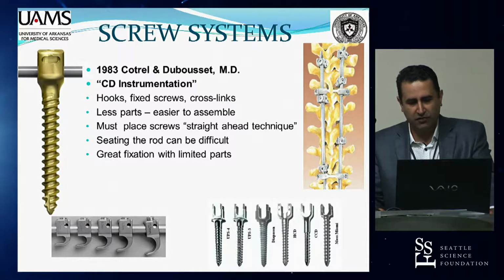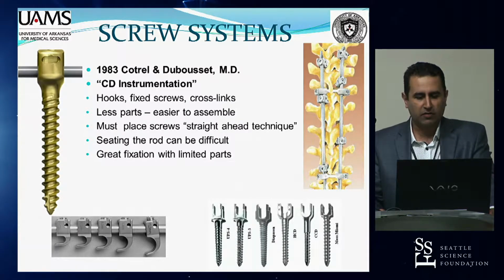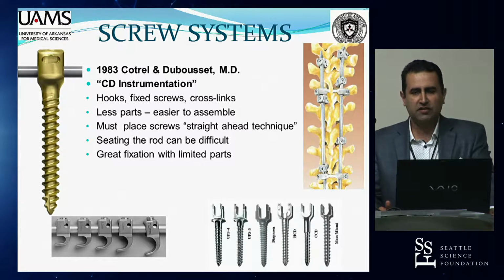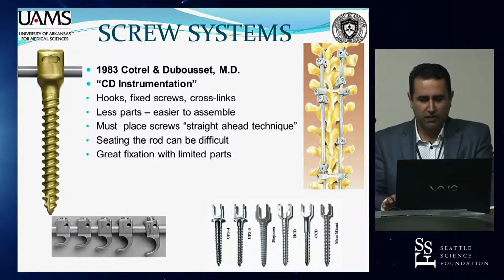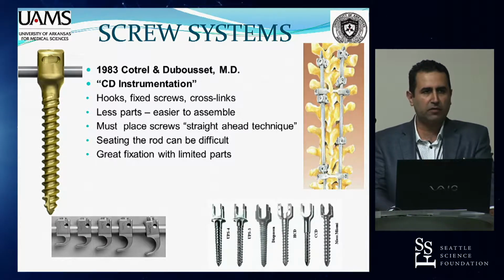It was cumbersome to some extent, the earlier parts to it. The screws needed to be placed straight ahead. Seating the rod was difficult. There was a lot of fixation, however, with these limited parts. And again, it was a quantum leap in terms of the available instrumentation.